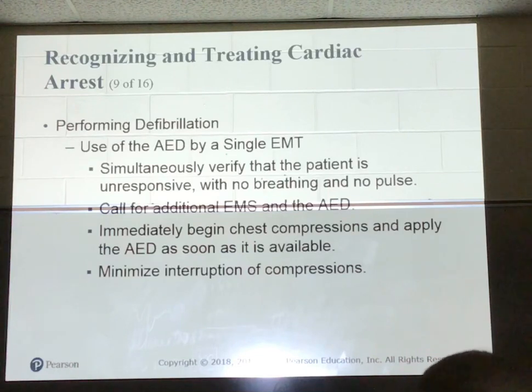All right, performing defibrillation. Use the AED by a single EMT. Simultaneously verify that the patient is unresponsive, no breathing, no pulse. Call for additional EMS and the AED. Immediately begin chest compressions and apply the AED as soon as it is available.